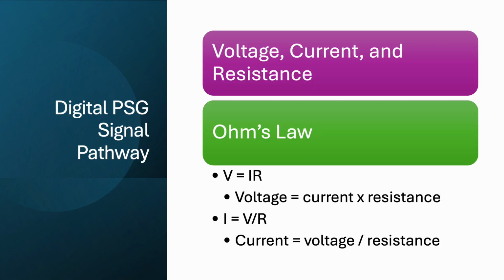This is a very basic formula to figure out either the voltage or the current, where voltage equals V, current equals I, and resistance equals R. Ohm's law indicates that under conditions of constant voltage, meaning if a circuit's closed and we've got constant voltage going, if resistance is increased, current or flow of the electrons will be decreased. In the signal pathway, there are several factors that contribute to higher resistance, and technologists must be vigilant in decreasing these effects. We're going to have a whole part just on Ohm's law, so don't stress out about that too much yet.